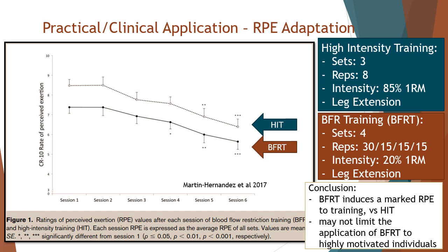And that's going to be session number 1, and session number 2 may feel just as hard, but you're going to acclimate to this. It's going to get easier. The first cut is the deepest, so on and so forth. But progressively over about 5 sessions, you're going to find this to be a little bit easier. And that's around session 4, maybe session 3, depending on where they're at, is where you're going to try and gradually progress some exercise variable to up the intensity such that you don't get diminishing returns on your adaptations.